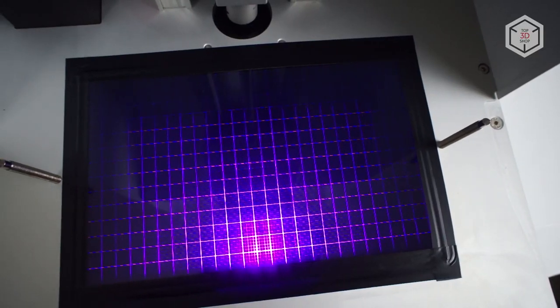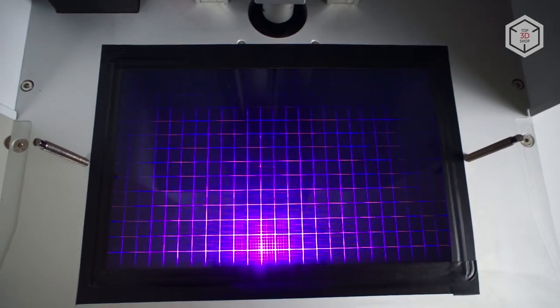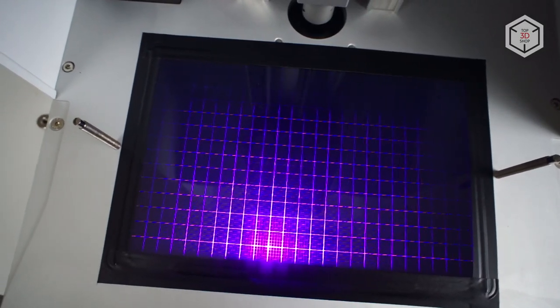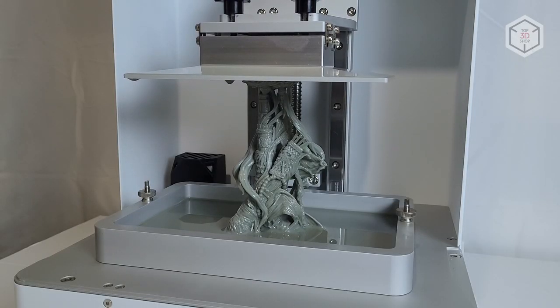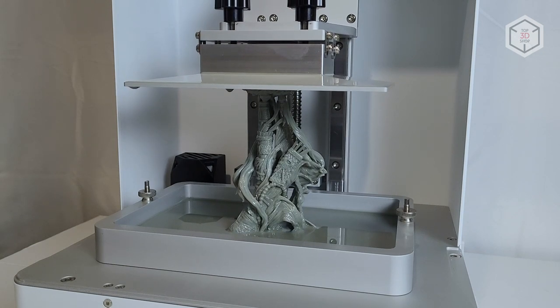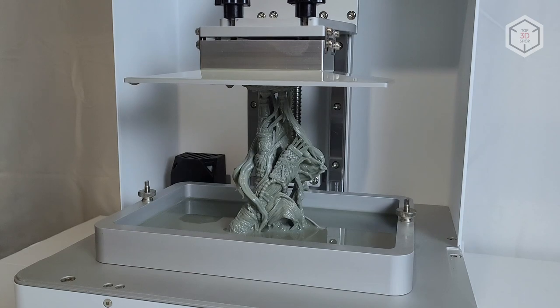The LCD panel projecting the layer images has a diagonal of 8.9 inches with 4K resolution. Thus, the size of each pixel is 50 micrometers. This is roughly comparable with the specifications of compact resin 3D printers, such as the Anycubic Photon Mono or Elegoo Mars 2 Pro with 2K screen resolution. Such accuracy is usually sufficient for most tasks, except that it may seem not enough to jewelers. But for dentistry, technical, and artistic objects, this level of detail will be sufficient indeed.